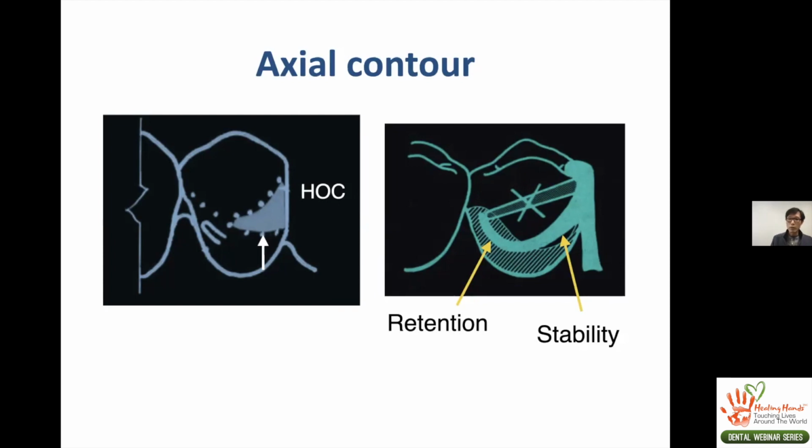And if you look at the clasp arm as shown on the right-hand side, in a curvilinear fashion, the initial two-thirds sits pretty much at the middle, and the terminal third is tucked into the undercut. The terminal third actually swings up in the occlusal direction. So even though this is a circumferential Akers clasp, the way the tip of the retainer works is more like mimicking an infrabulge clasp, which is an I-bar. So this is more like a push type instead of a pulling type. So the retention can be more efficient, even though this is in general a pulling type of clasp assembly.